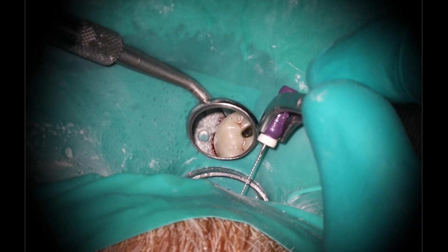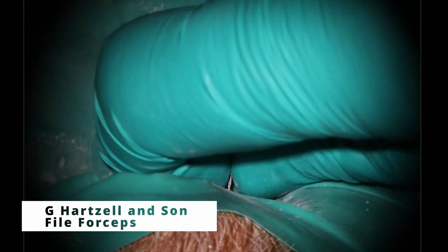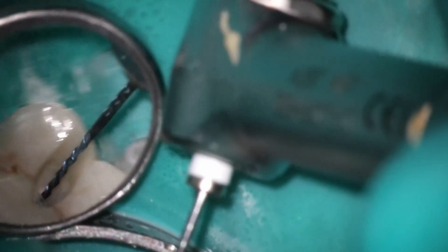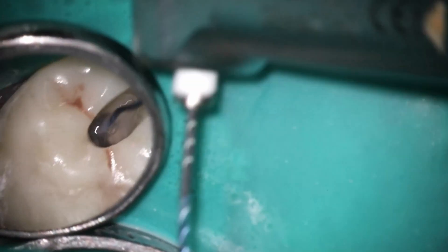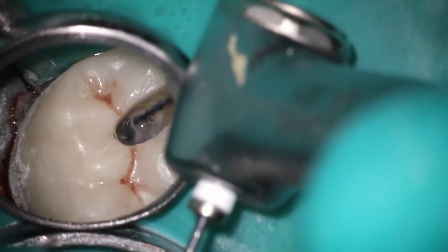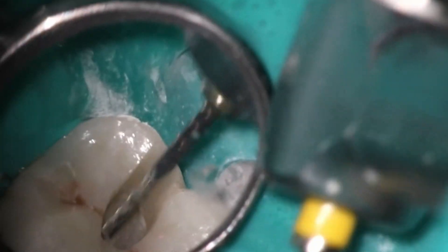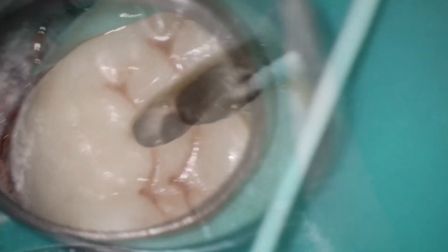I place the file using the little file forceps — that's probably the most commonly asked question. Those are from G Hartzell and Son; just talk to your supplier. Working down, probably getting to about 16-17 millimeters. The rotary file is dropping down a lot farther there — we're almost patent, almost down to the bottom, still buckling a little bit, which tells me there's a little bit of calcification at the apex. If you find that you're starting to have that buckling with these heat-treated files, take them down the other canals — that usually straightens it back out and gives you a little bit of that stiffness back. I only work about a millimeter at a time, and at this point we're pretty close to where my working length is.